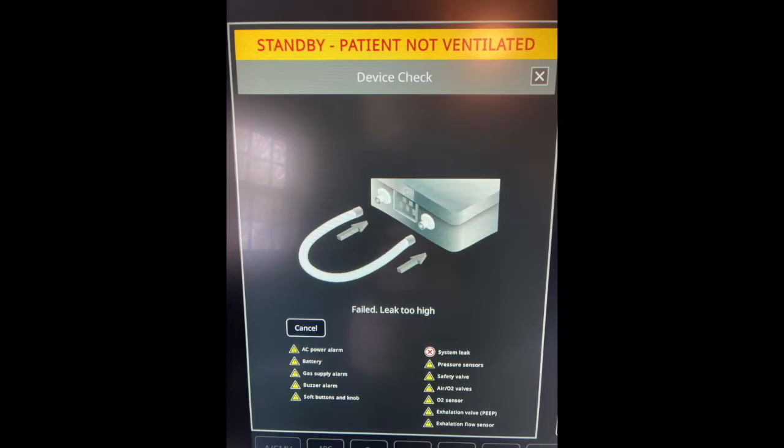When performing a device check and my system leak test fails, there are three reasons. One is my test tube resistance and compliance is too high, and this is highly unlikely if you're using the tubing that was sent with the ventilator. You might have this if you're using another piece of tubing. Or your pressure did not reach 60, or your pressure is dropping due to a leak.